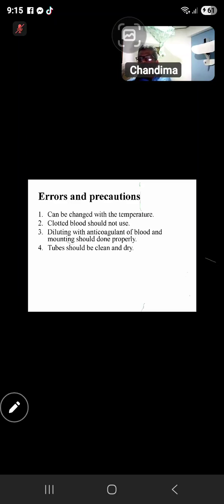What is the minimum blood volume in a 2 ml EDTA tube for automated analysis? It depends on the type of tube. If it is a liquid one, you have to collect 2 ml, right? If it is a pediatric one, it is not a problem. But if the tube says you have to collect 2 ml, you have to collect 2 ml. Why? If not, EDTA changes could occur.